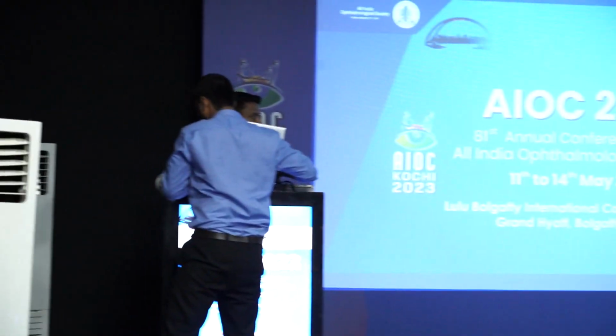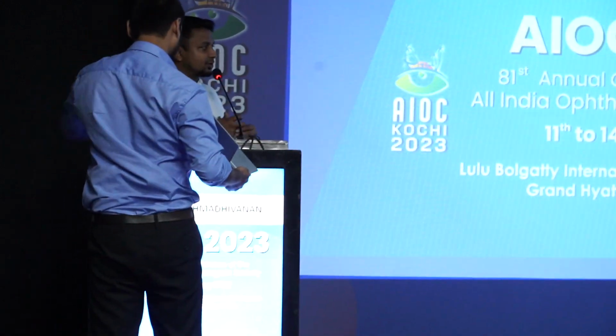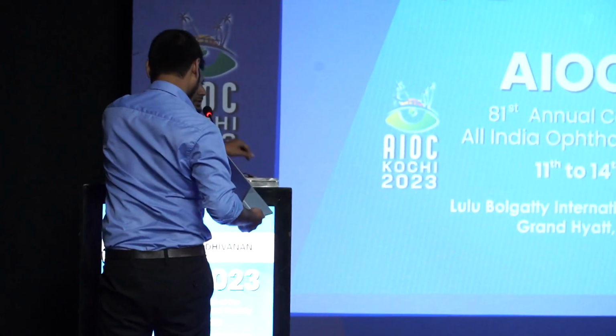Do you keep updating the machine as and when the Presbyond gets updated? In Schwind it is Presby Max; Presbyond is the Zeiss one. What they have, I have not updated for the past 7 years. It is the same module which has been there from the beginning, because the Schwind Amaris has brought this. The previous Schwind did not have this Presby Max.